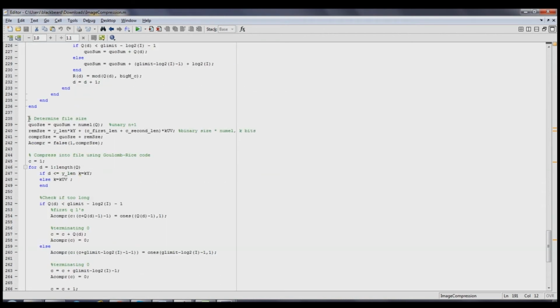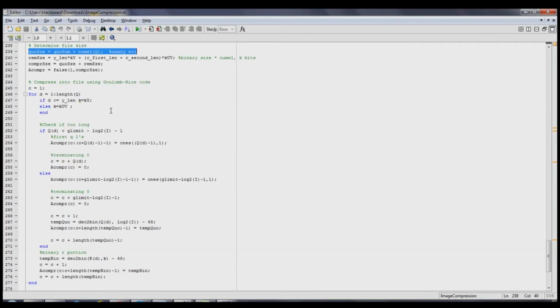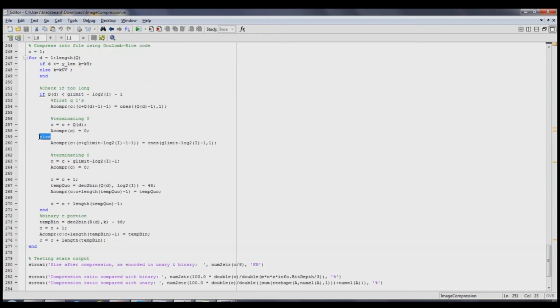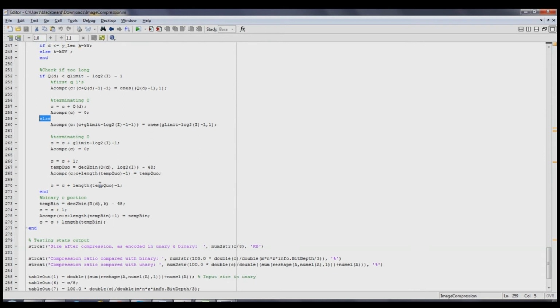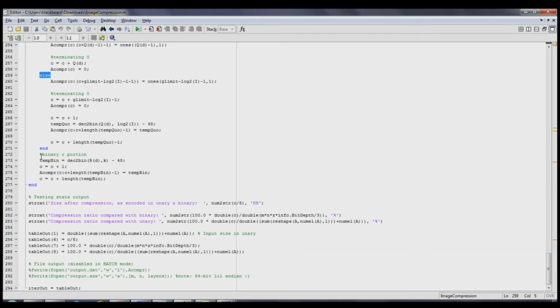So in line 239, you can see the file size is determined as a sum of quotient size and remainder size plus blank file space allocated. Next, the file is encoded by first checking if the quotient is too long for a unary encoding. If so, encode an escape character in unary followed by the quotient in binary. Else, encode the quotient in unary. Finally, encode the remainder in binary and add to file.